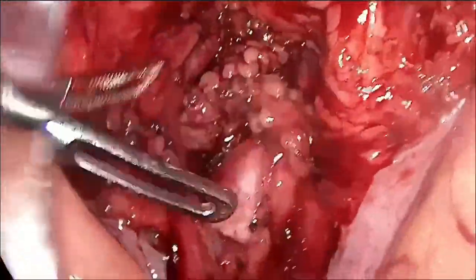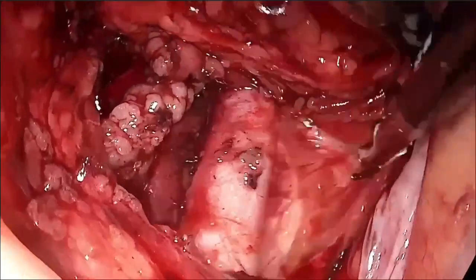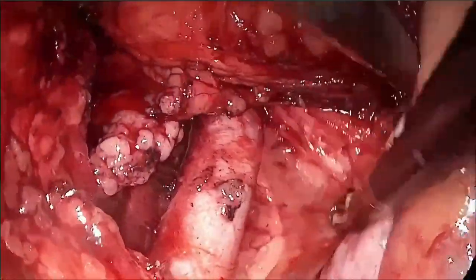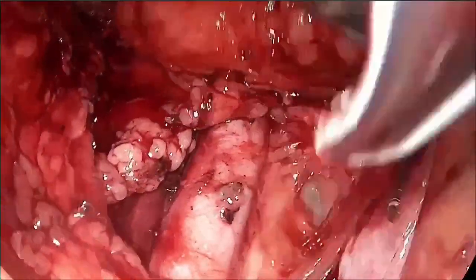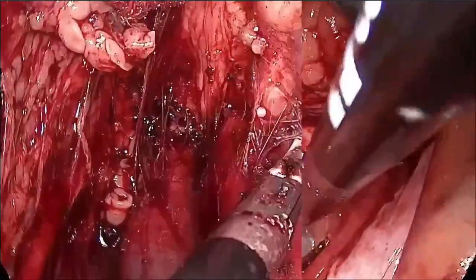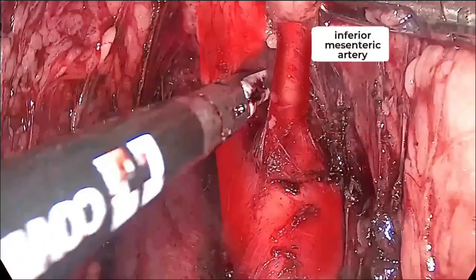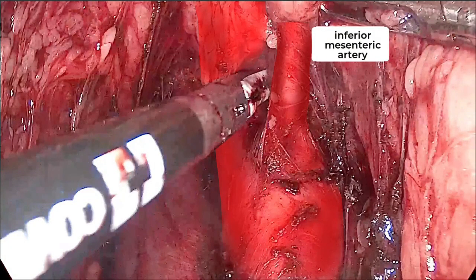The dissection is extended to expose the anterior wall of the aorta and the left para-aortic space, thus enabling access to perform the intercaval aortic dissection. The origin of the inferior mesenteric artery is identified and dissected.